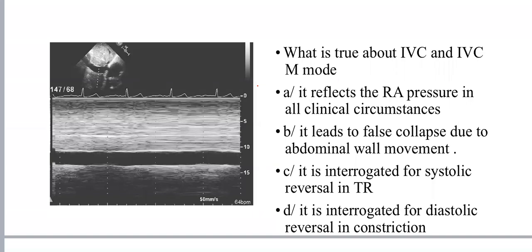Okay, so you lose the image altogether. You lose the image or the focus on the IVC. So you get something like no IVC and IVC again. When you don't get the IVC, you assume that it's completely collapsed during this time, and then you get it again. So that's an important error you have to take care of.